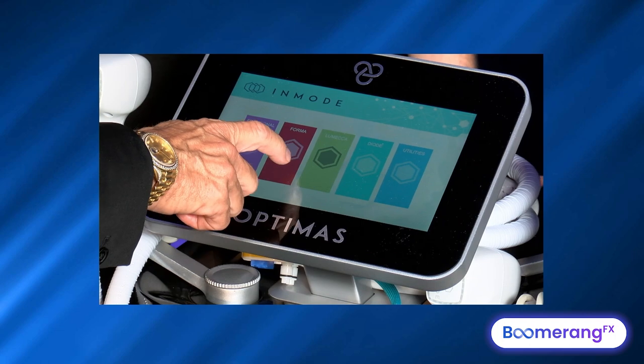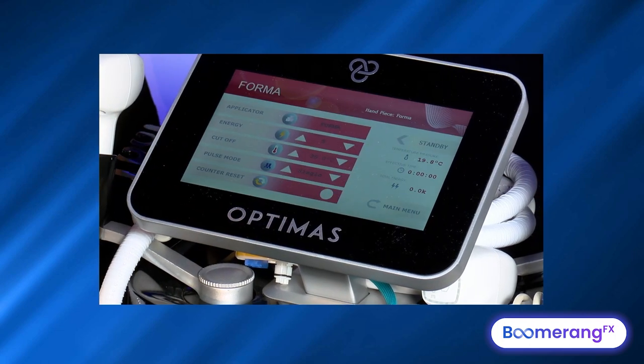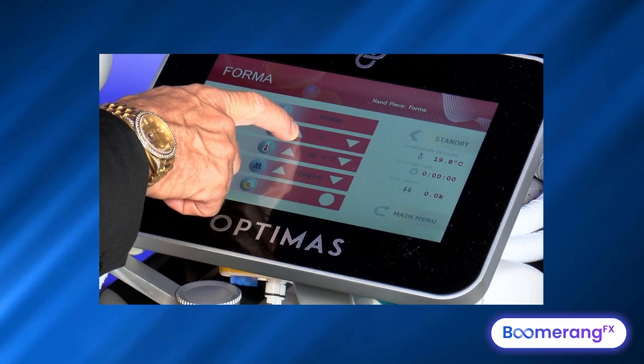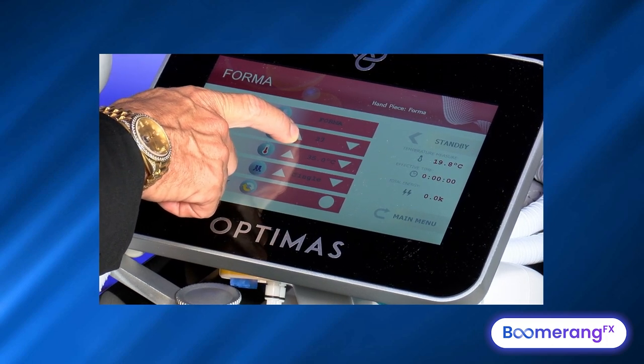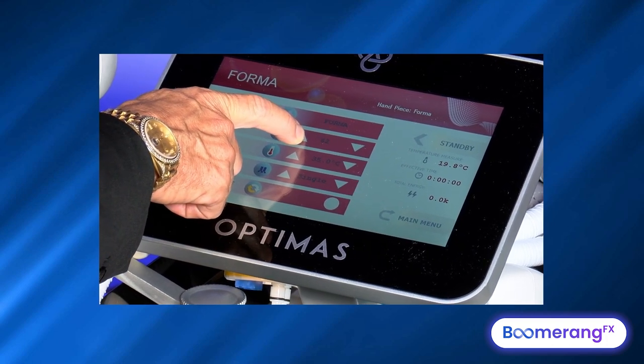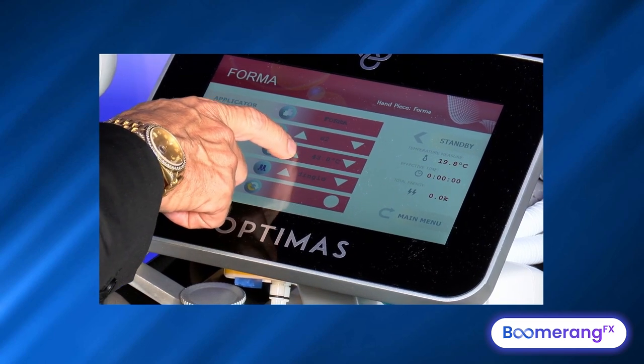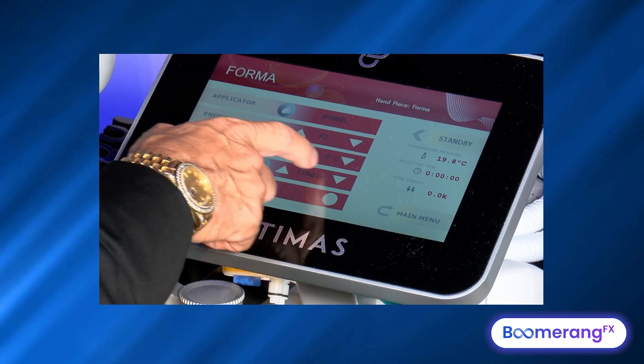We've already done our IPL. Now we go to the Forma. We hit Moving Bulk Heating Temperature Controlled RF and use the Forma applicator. Typically we'll be between 50 and 60 millijoules for the smooth electrode, and we'll be heating up to 43 degrees. This is for demo purposes, so we'll be a little bit quicker today.